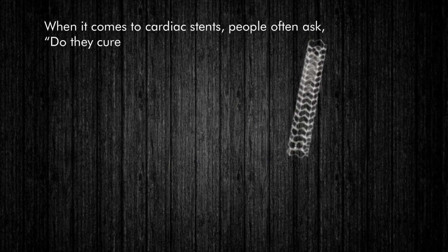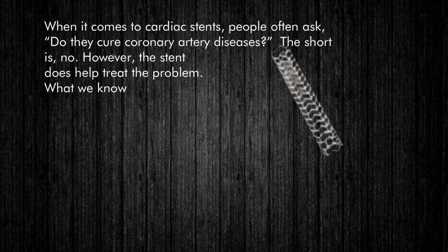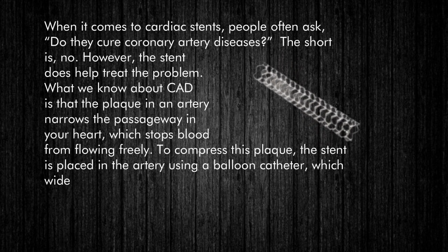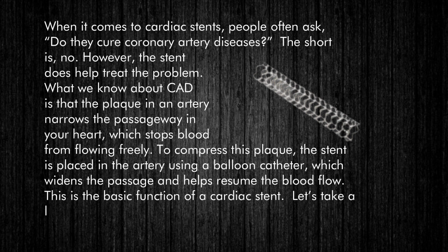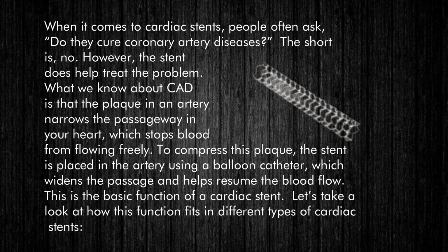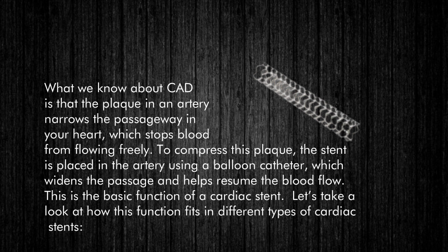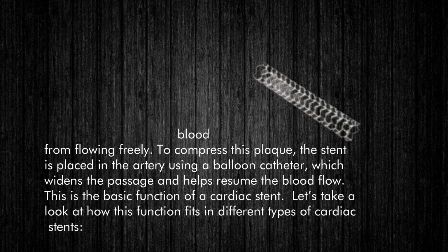When it comes to cardiac stents, people often ask, do they cure coronary artery diseases? The short answer is no. However, the stent does help treat the problem. What we know about CAD is that the plaque in an artery narrows the passageway in your heart, which stops blood from flowing freely. To compress this plaque, the stent is placed in the artery using a balloon catheter, which widens the passage and helps resume the blood flow. This is the basic function of a cardiac stent.